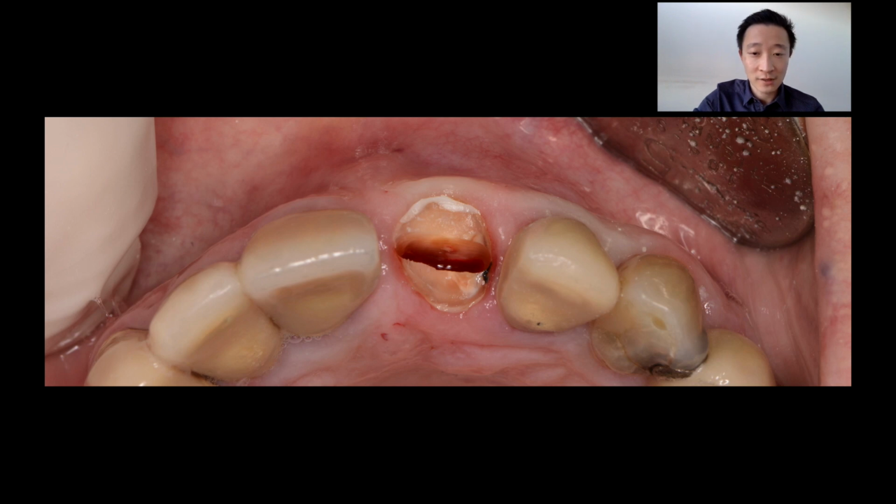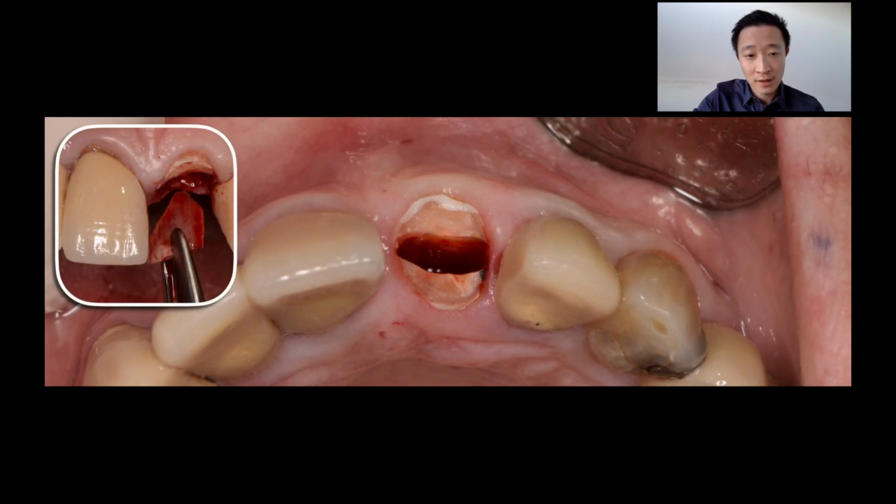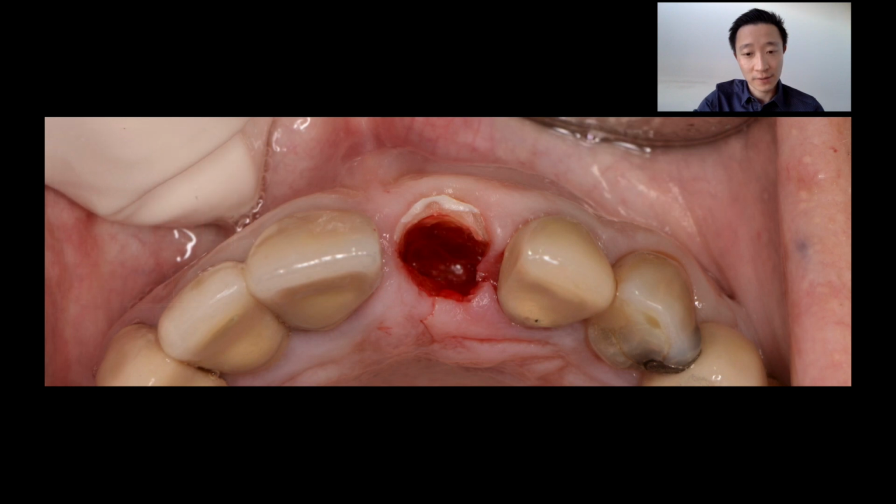Here we see a mesial-distal cut. So this cut was not, as a mistake of mine, all the way down through the canal, and therefore the piece, as you can see, that I'm removing is not the length of the root. The root was much longer than this. So that left me with more of a palatal portion at the apex, which we had to trim away slowly with the burrs. So this took a little bit longer.